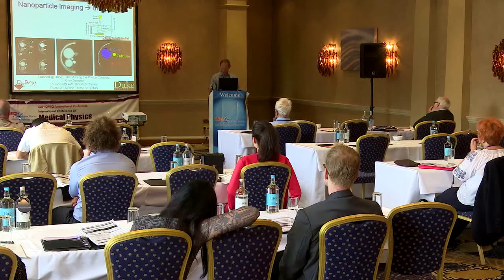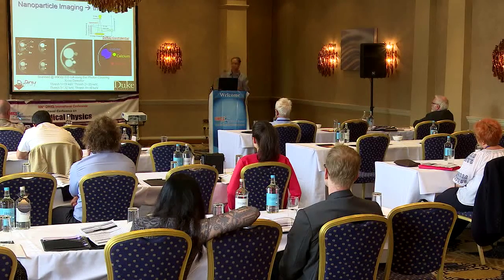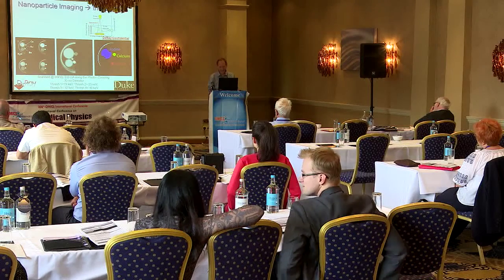And here you can see that by using 4 different energy windows, we can separate and identify and image the individual elements separately using the K-edge method of placing an energy window above and below the K-edge of the particular material, and then subtracting those 2 images, and then you'll pick up a large signal increase across that K-edge.